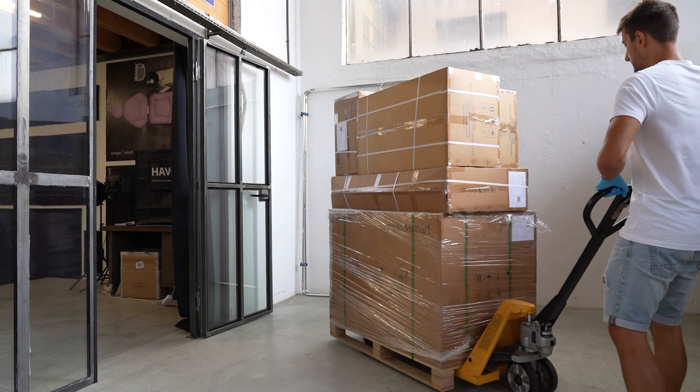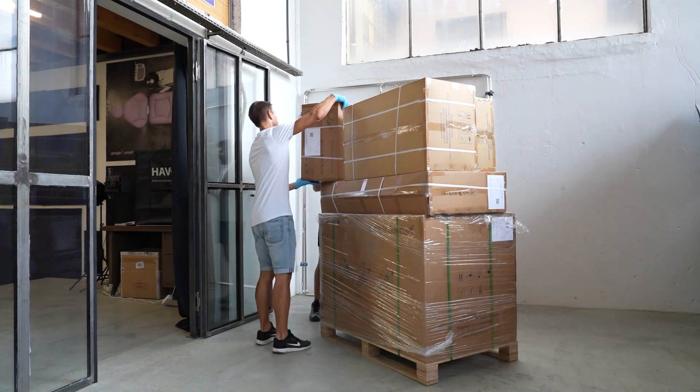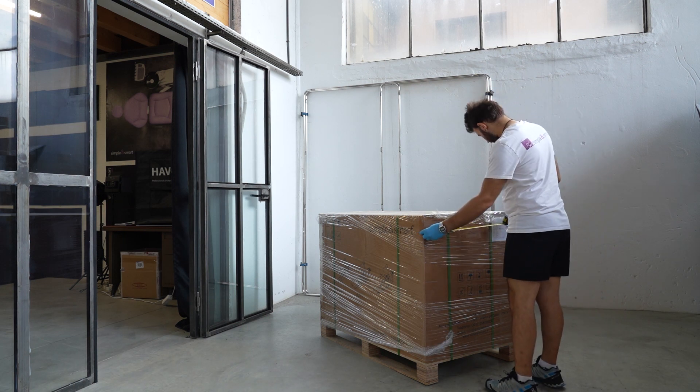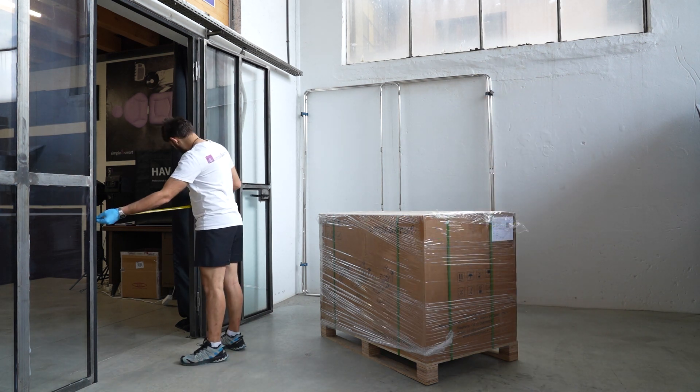This is the new simple and smart dental unit packaging. Before bringing the unit inside the clinic, check if it fits through the clinic door.